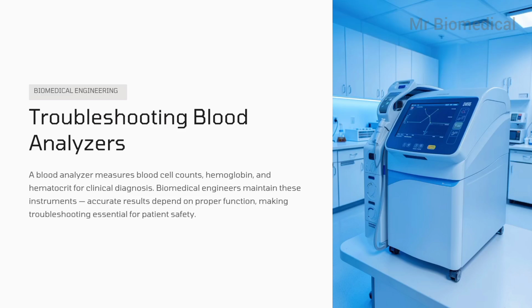Have you ever wondered how doctors can quickly know if a patient has anemia, infection, or a blood disorder using your blood sample? The answer lies in a blood analyzer. These advanced laboratory instruments measure blood cell counts and hemoglobin levels within minutes.